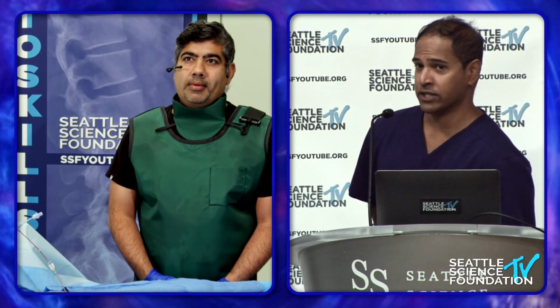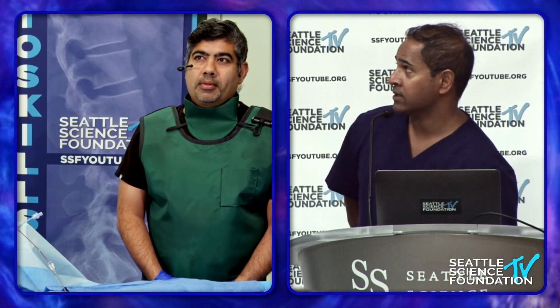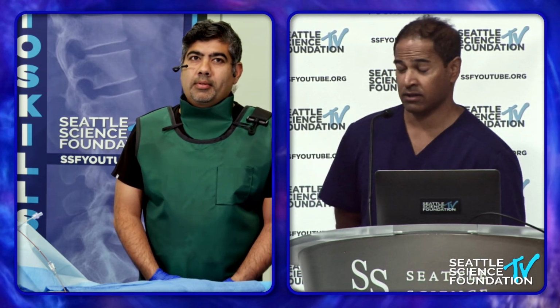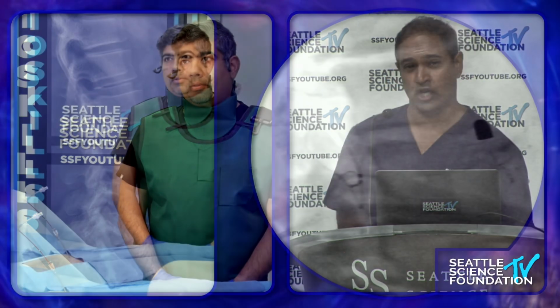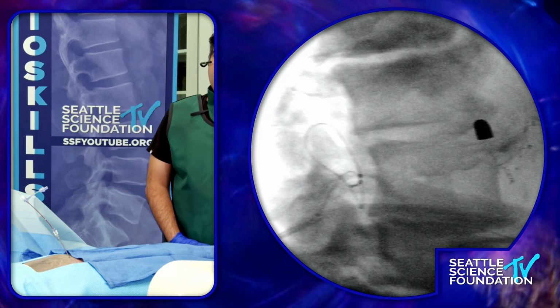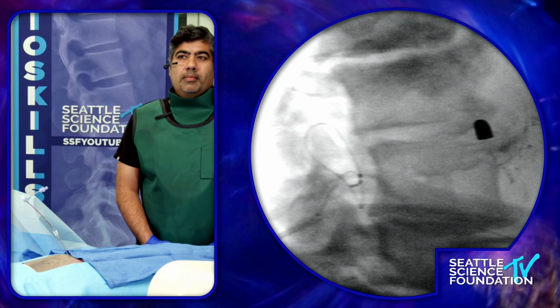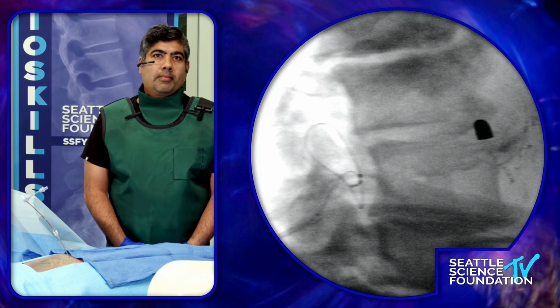Absolutely. So always good to look at your perineural fat on a parasagittal T1 sequence on your MRI to look how much space there is. If there's severe neuroforaminal stenosis, you may consider that challenging, but not a contraindication. You may just let the patient know, hey, this may be more challenging. And if that occurs, you can always go to a level above or below because of the convergence divergence of DRG. Between PNS and DRG, that's a great question.